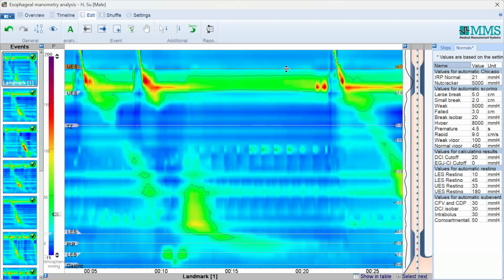There are two lines here. It should be within these two lines. In general, for an adult, usually the depth of the probe is between 43, 44, up to 50, 52, 53. It totally depends sometimes on how tall the patient is, but this is the average insertion.